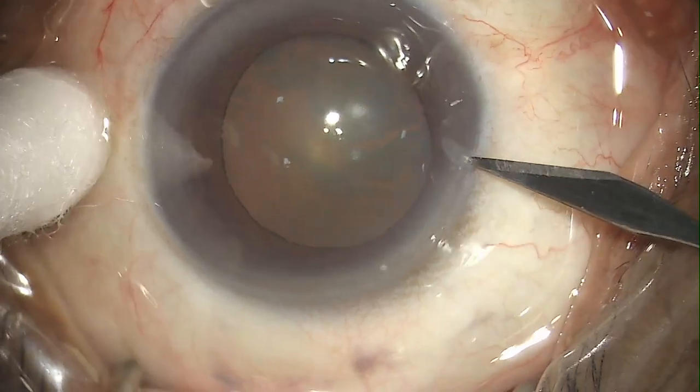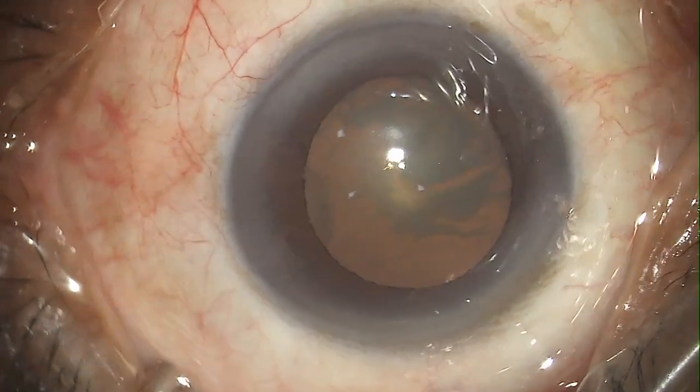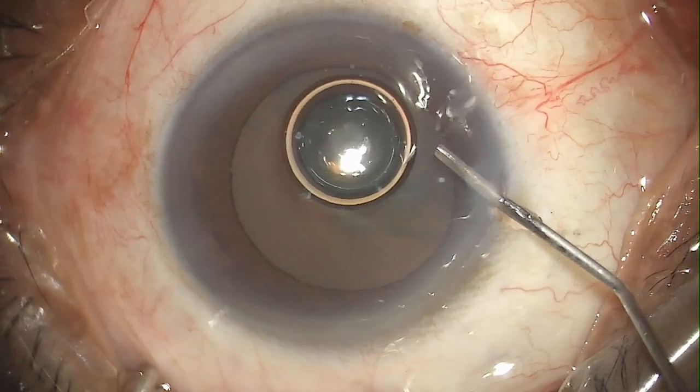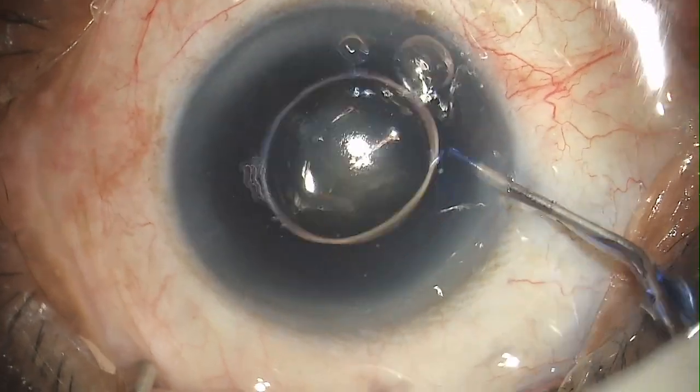Hi friends, this is Dr. Ashwin. This is a case of a 64-year-old male patient with a relatively softer cataract that is NS 1 to 2 grade with dense PSC.